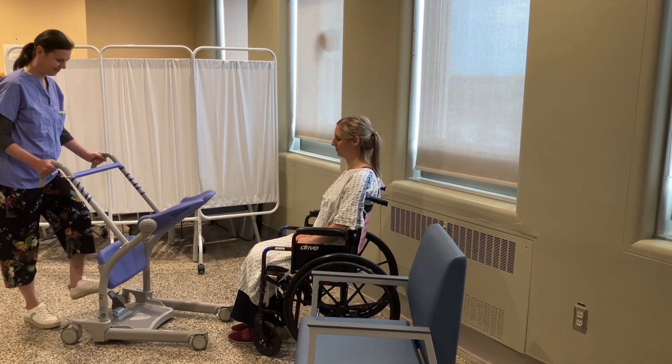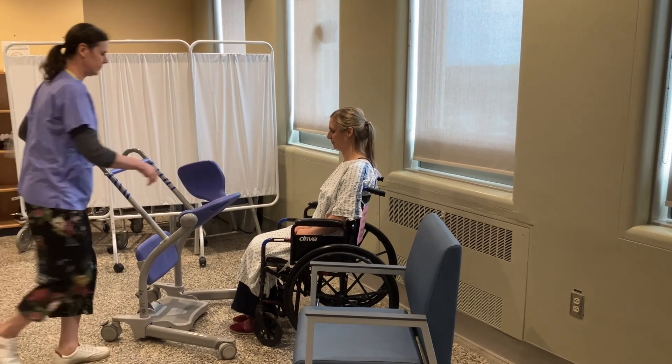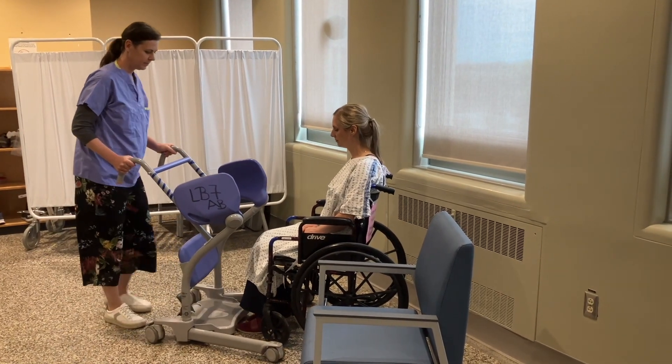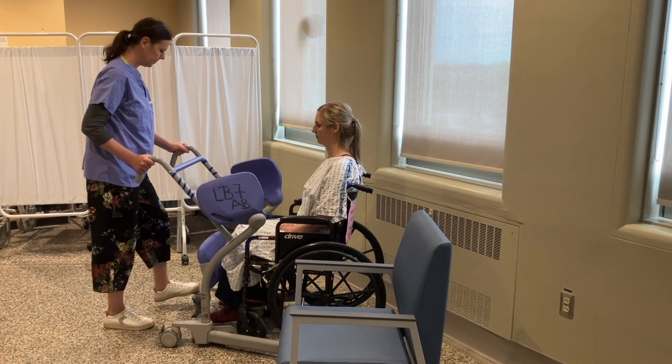Move the Sarah Steady to the patient and widen the legs of the Sarah Steady if needed. Swivel the seat flaps out of the way. Tell the patient to lift their feet onto the platform and wheel the Sarah Steady forward until the shin blocks touch the patient's shins.